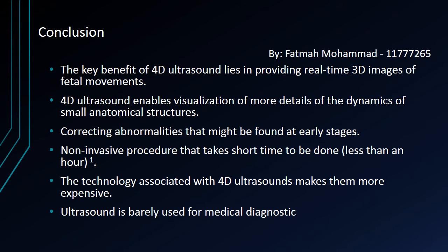4D ultrasound enables visualization of more details of the dynamics of small anatomical structures and correcting abnormalities that might be found at early stages. Moreover, it is a non-invasive procedure that can be done in a short time, as it will take less than an hour.